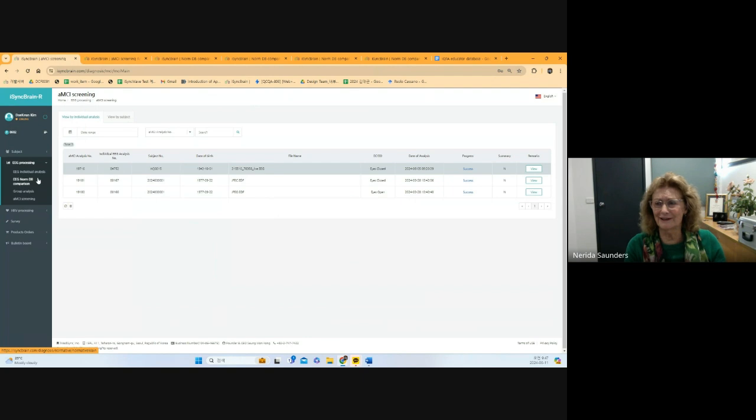Can I? I know I talk a lot, and I'm sorry, but the spectra itself, the spectra map that you have there. Is it possible to use brighter colors with that? Because we often put that in reports for people, but it doesn't come up very well. And if we could use brighter colors, I think it would look a lot better.